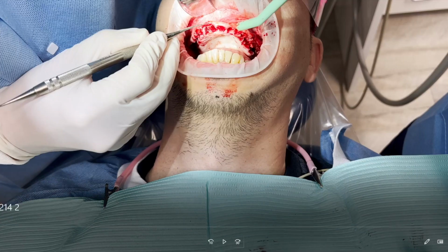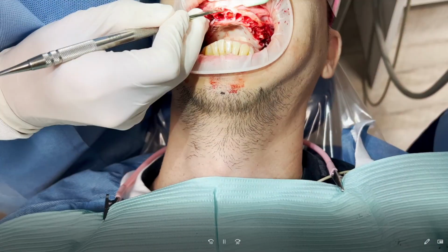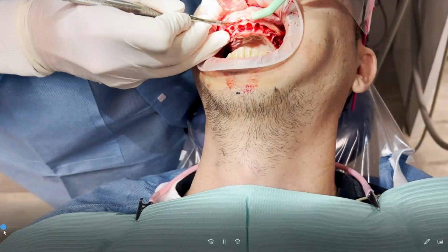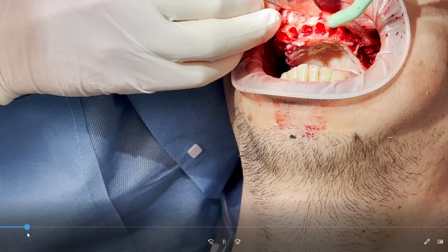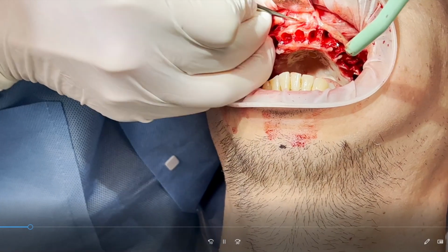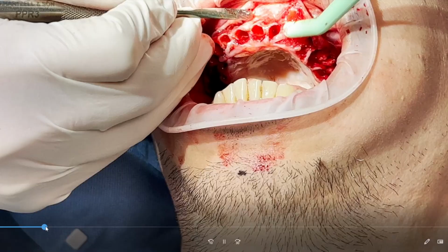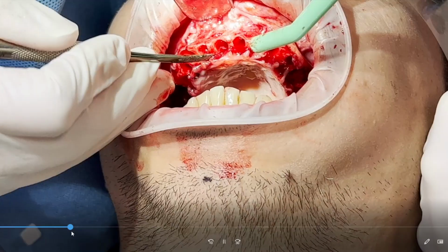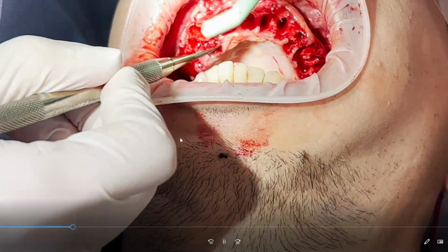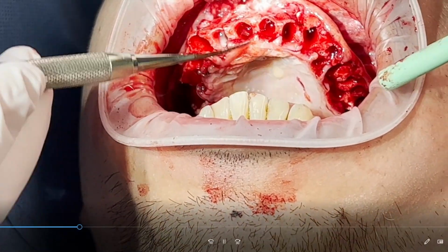So here he is after he's had all his teeth extracted. And I turn the volume off here. What I'm doing is I'm now separating the gums from the bone. And you can see right there, you see each individual tooth socket, right? All right, so here we go. Now I'm separating the gums, pushing in that area. Oh, yep, got some pus coming out. That's purulent exudate.